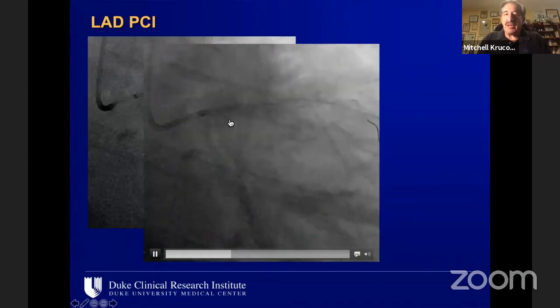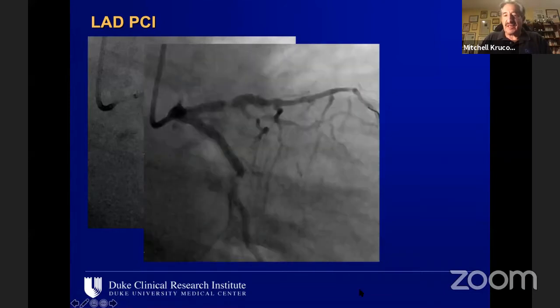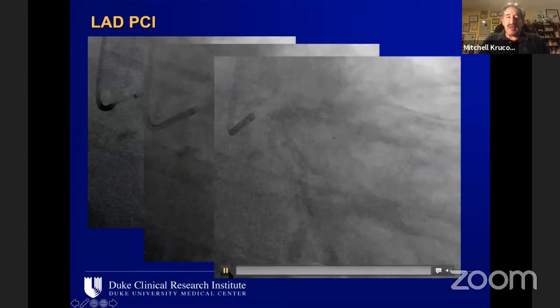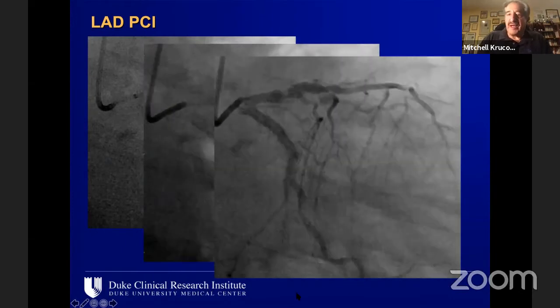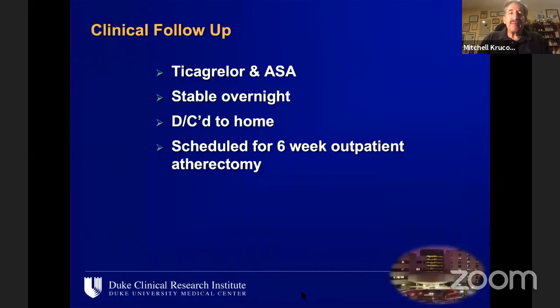After the balloon attempt on here, you can see there's a dissection on both the proximal and distal edges of the lesion. And what we did was withdrew the wire and just waited for about 20 minutes and watched. The lesion was stable, the patient was stable. So we put him on ticagrelor and aspirin, watched him in the hospital overnight. He was fine, walking around comfortable, sent him home and scheduled him to come back after the dissections potentially had healed to do an atherectomy gently as possible in the midst of that ectatic segment, and he died at home 2 days later.